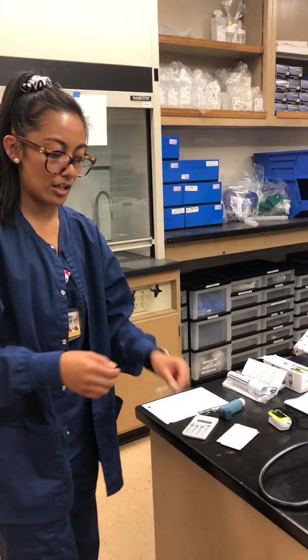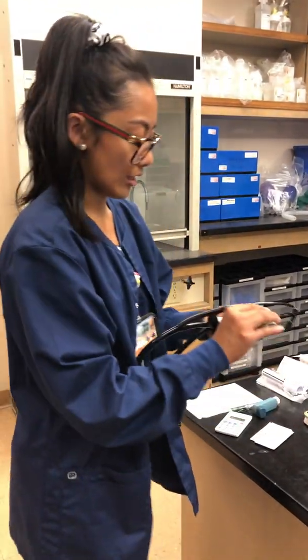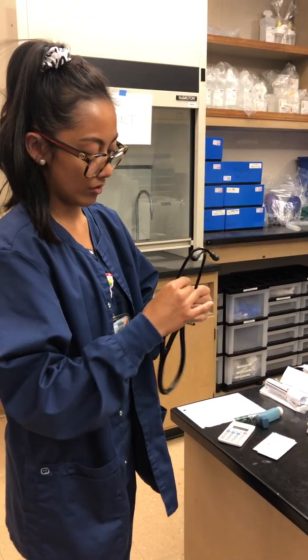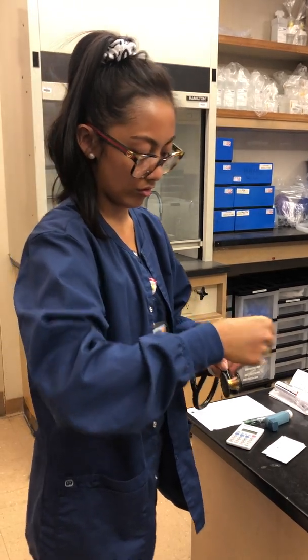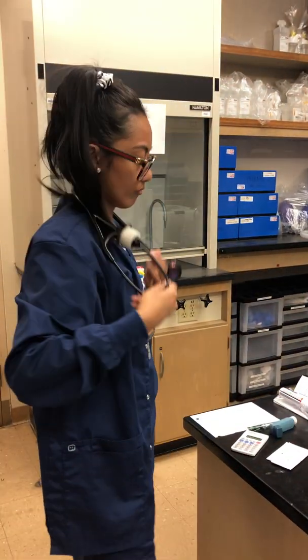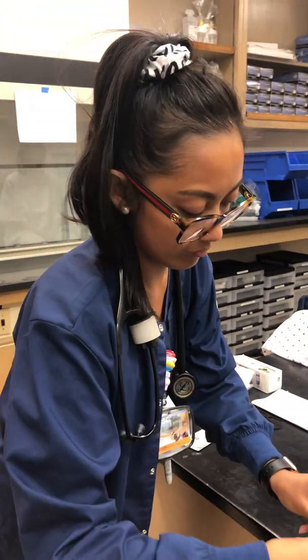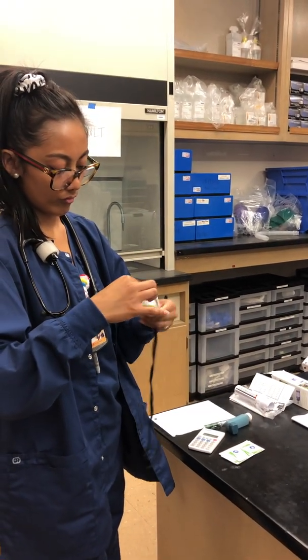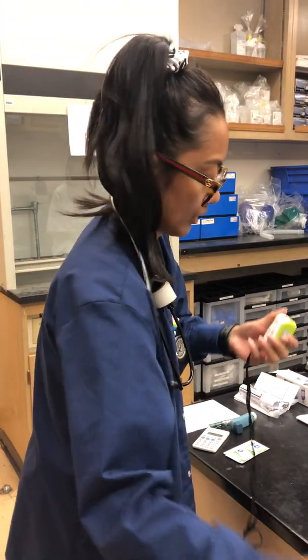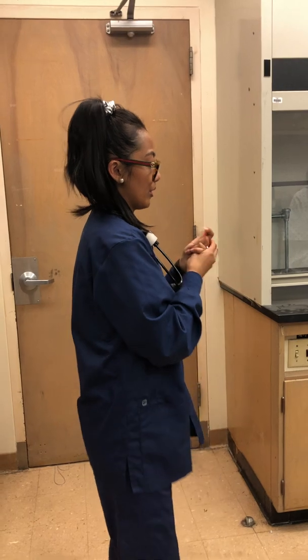So I'll start by sanitizing my stethoscope. Sanitize the bell and the ear pads or earbuds. And the pulse ox. And then placing this in my pocket, and then sanitizing my hands again with at least 3 ml for 15 seconds, and then we'll enter into the patient's room.